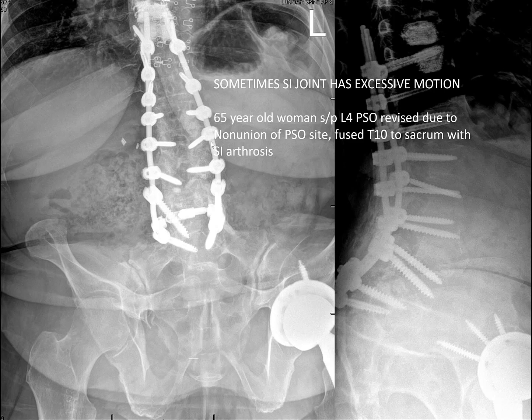This is another case. I revised this case, but I didn't do the first one. Basically, it was a PSO that had a non-union, and I revised it because it failed and the implants broke. And look at her sacroiliac joint. I just saw her last week in the office. That's where she's probably moving, and she has a lot of low back pain. You can see how it's sclerotic, it's widened, definitely diseased.